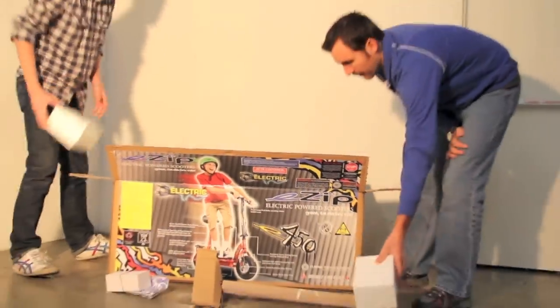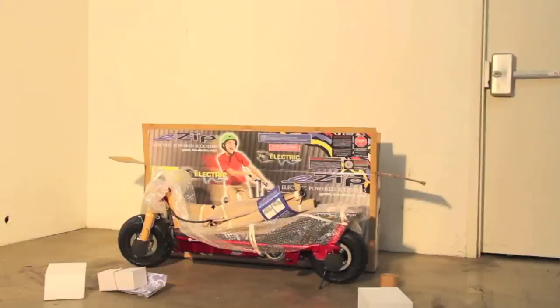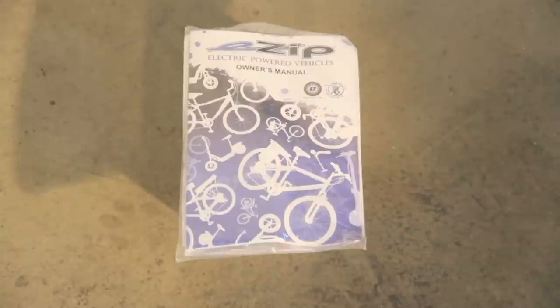Remove the foam separators that protect the components from damage during shipping. Remove the scooter from the box. Inspect the scooter for any scratches, dents, or damaged cables that may have occurred during shipping. Before using the scooter, be sure to read and understand the owner's manual.